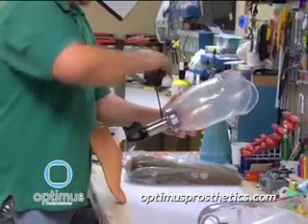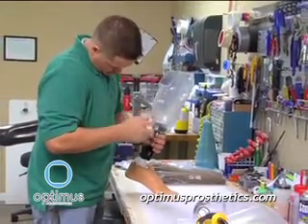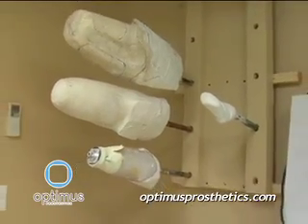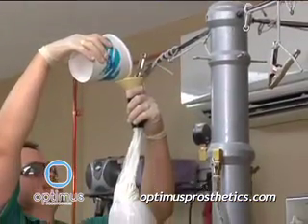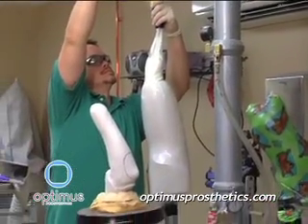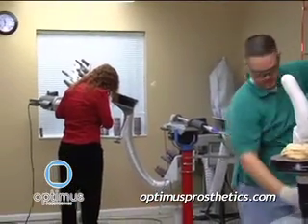You know, a lot of prosthetics is combining componentry to the interface to the limb. And the interface to the limb is the custom-made prosthetic socket that we fabricate in-house. So a lot of engineering goes into that. It makes a good marriage for bringing that innovative technology, marrying that to the traditional values.